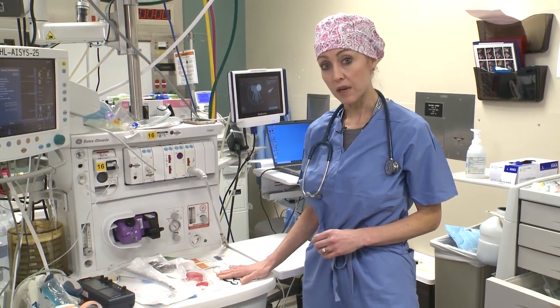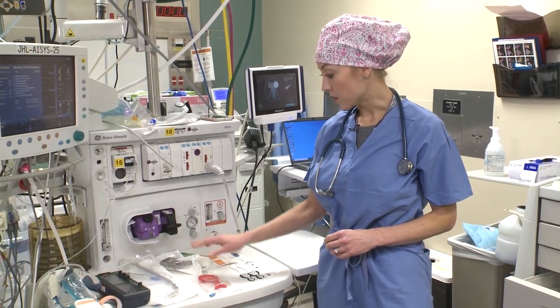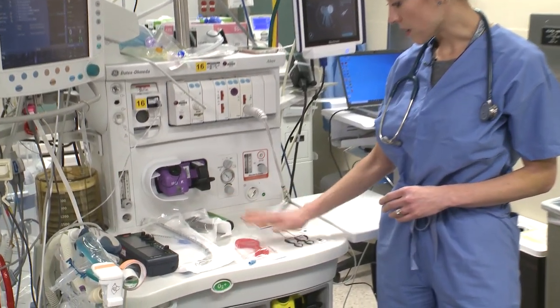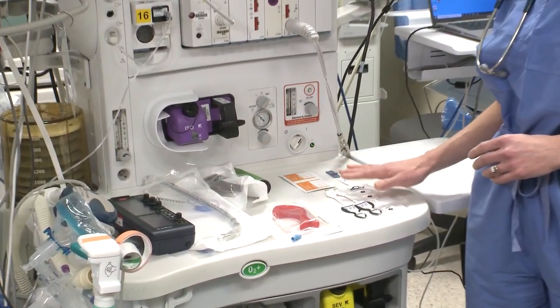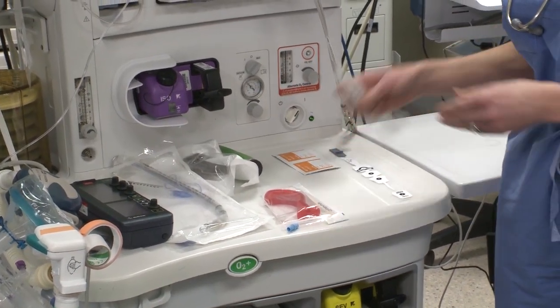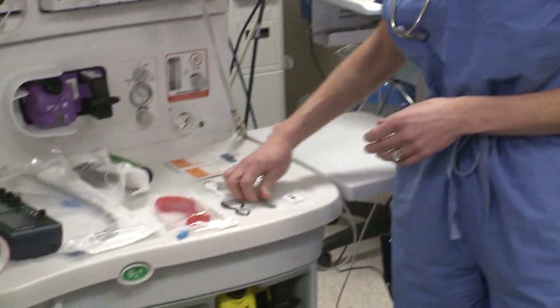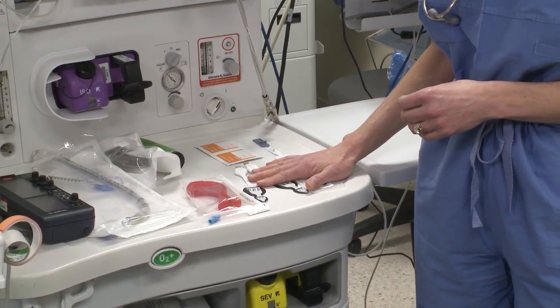As part of your setup, you will obviously have your airway, your blades, all the normal stuff, but I also want you to have your neuromonitoring stuff ready. You will have two cerebral oximeters and also your BIS, and we're going to go over placement of that in just a moment.